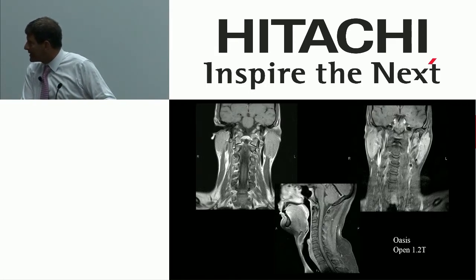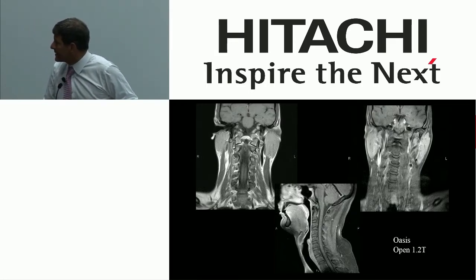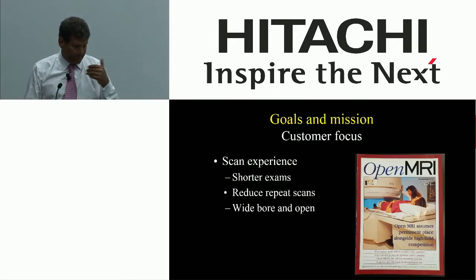Here's a T1 post-contrast, all 3 planes. Looks like I have here the non-fat suppressed and the fat suppressed together. Again, because it's free.